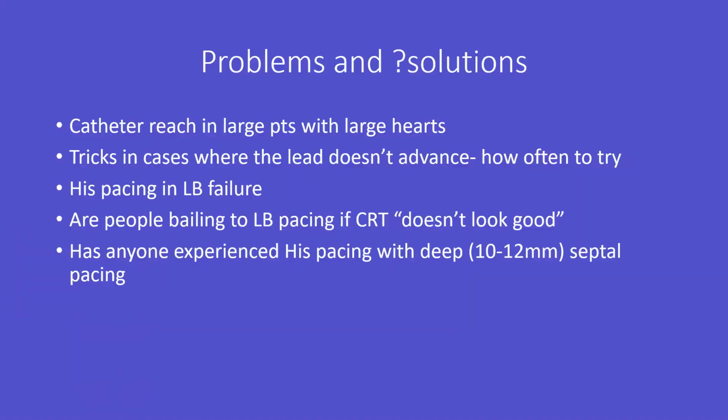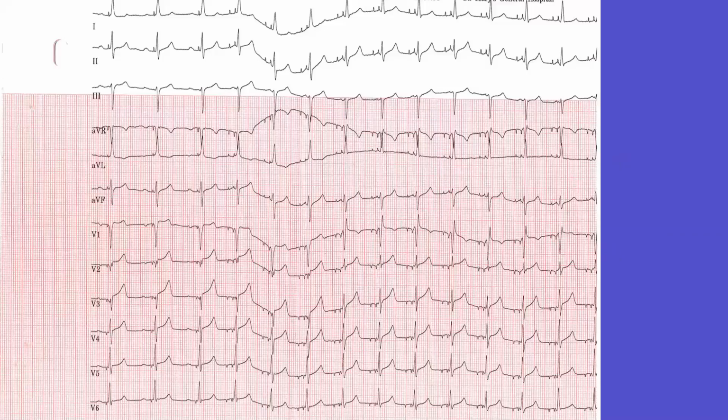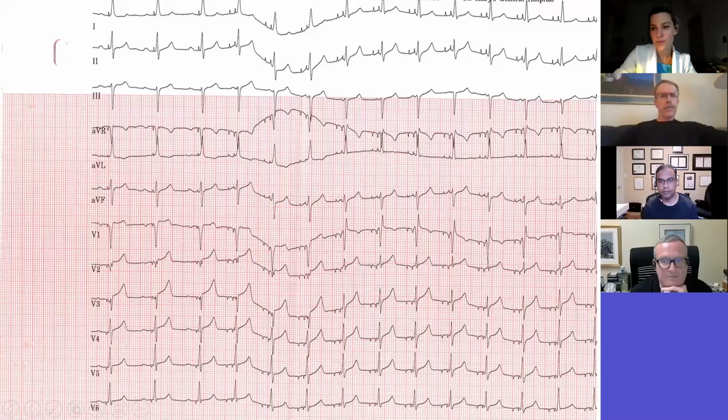All right, so I think the first one is from Klaus. Maybe Klaus, do you mind narrating through your slides? This was just doing a threshold, 12 leads. It's in bipolar, going from higher to lower, and you can see in V1 that you don't have an R wave, and then suddenly you get the classic R wave. Obviously, this is the follow-up, not during implant. And so halfway through, you're getting that.